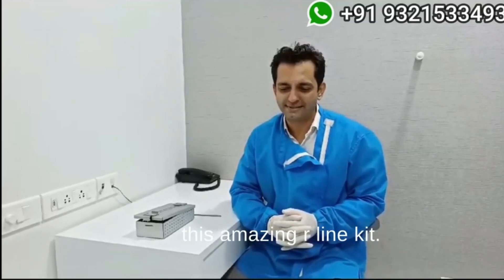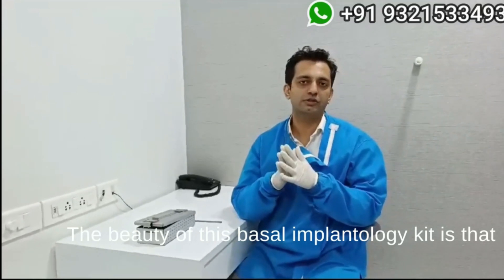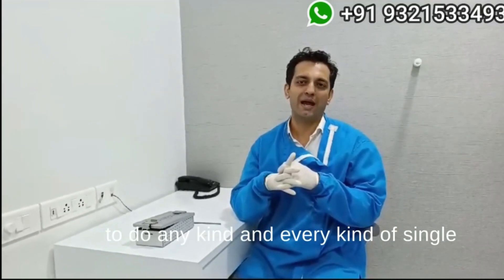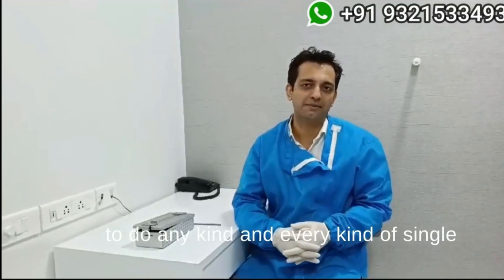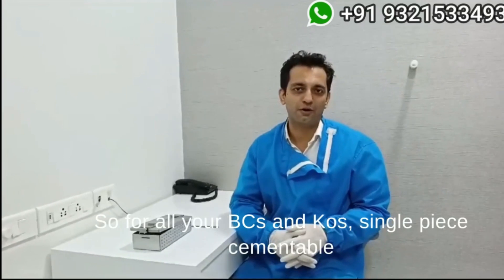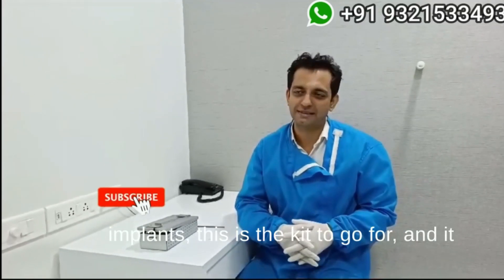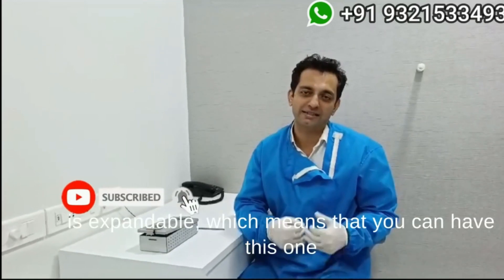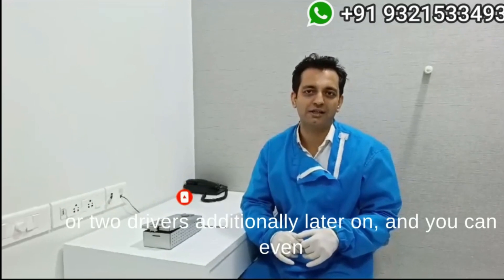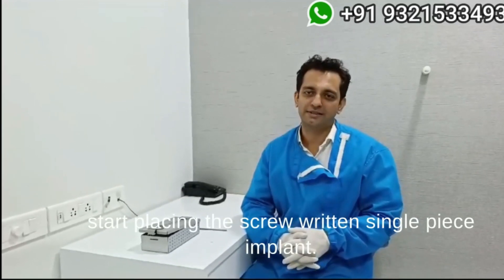Today I am going to demonstrate this amazing R-line kit. The beauty of this Basel Implantology kit is that with just this one kit, you will be able to do any kind and every kind of single piece implants except the zygomatic implants. So for all your BCS and KOS single piece cementable implants, this is the kit to go for, and it is expandable, which means you can have just one or two drivers additionally later on and can even start placing screw-retained single piece implants.